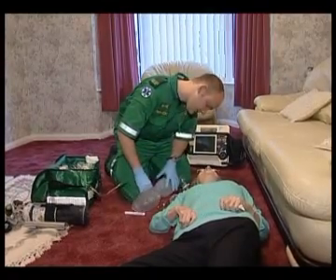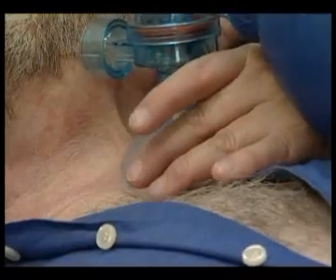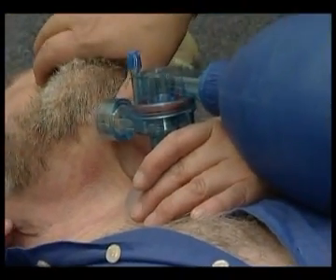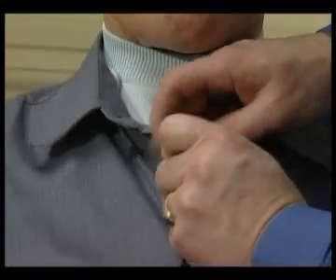When a paramedic resuscitates a laryngectomy or tracheostomy patient, all the dressing should be removed from the neck. The stoma or tracheostomy tube should be completely exposed, and resuscitation should take place via the tracheostomy with closure of the mouth and nose. Some outer covers may look just like clothing, and it's only once these have been removed that you can see any other covers and finally reveal the stoma itself.